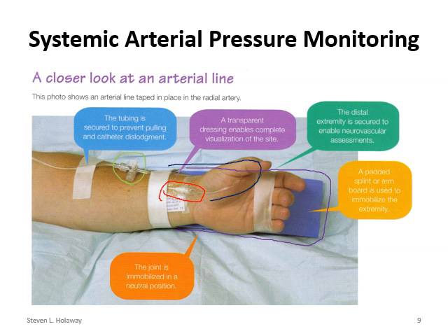So this is the arterial line, as you can see. It consists of a catheter, tubing, a three-way stopcock, and then this tubing goes back up to the transducer, which then connects to the monitoring system. So it's pretty easy, pretty straightforward.